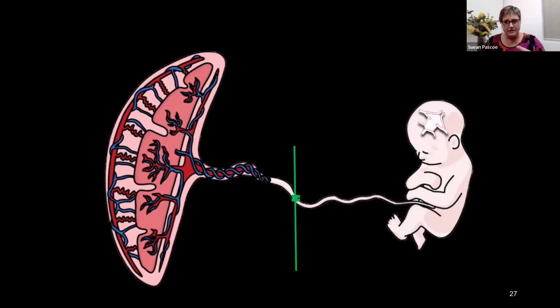When they flip around, when we have high resistance flow in the umbilical artery bed, that infers poor placentation and some sort of restriction to the umbilical flow. The baby then fights to preserve the vital organs. And so one of the vital organs is the brain. And so the brain then becomes really hungry for blood. And so then the middle cerebral artery trace will be low resistance.